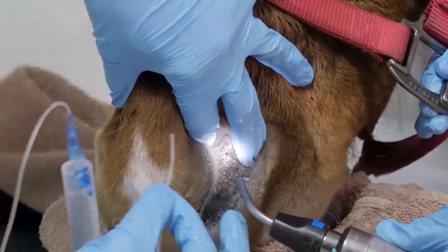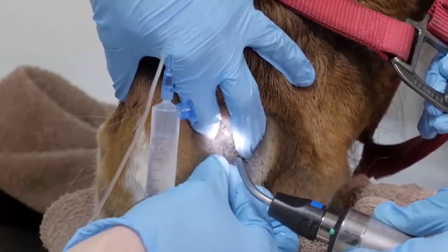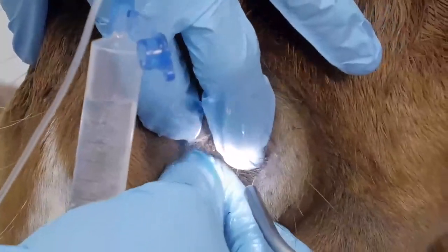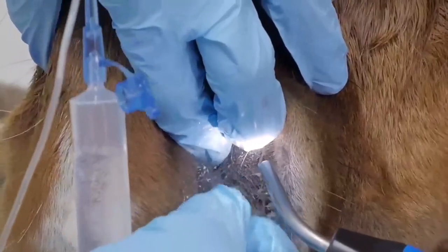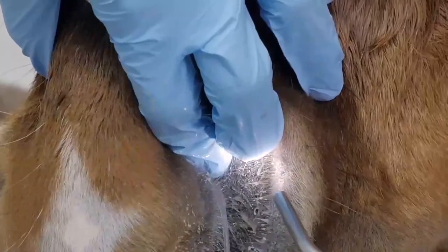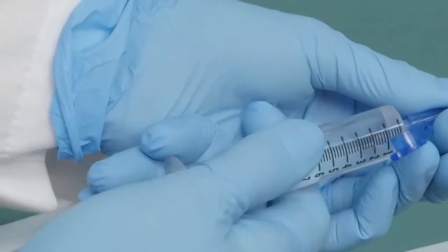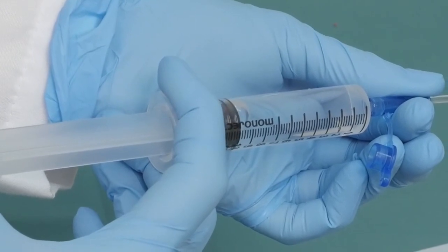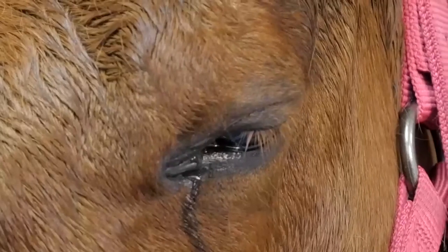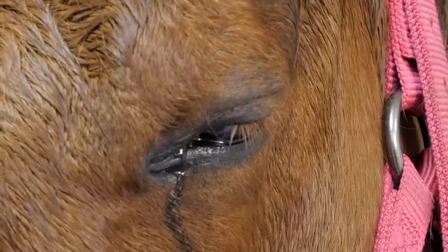The rounded end of this tube is fed approximately 5 centimeters into the nasal opening, and a finger is placed over the cannulated nasolacrimal orifice to maintain the catheter in place and to prevent back leakage of the irrigation solution. A 12 to 20 cc syringe filled with saline is then attached to the feeding tube, and the fluid is slowly injected into the nasolacrimal duct. If the duct is patent, the saline will be observed to drain from the upper and lower lacrimal puncta.